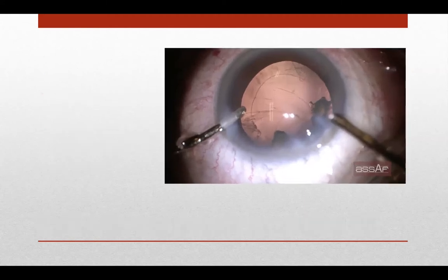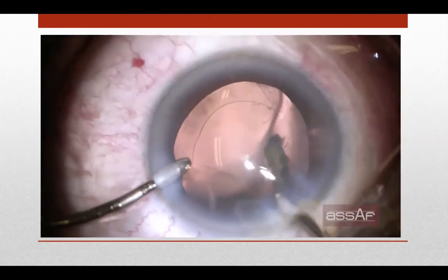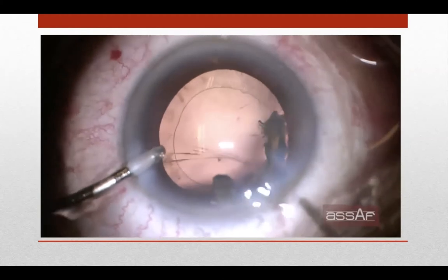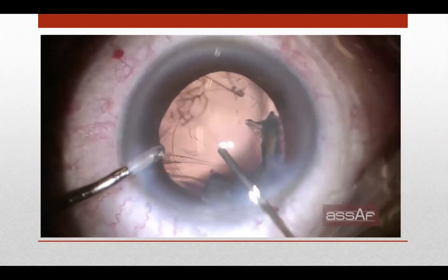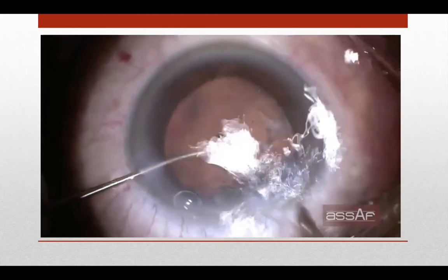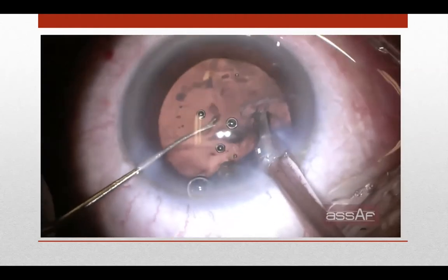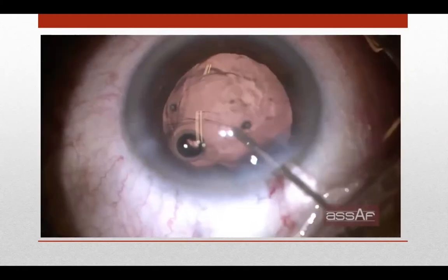So what to do in this case is, of course, we should stop, never allow the anterior chamber to collapse, and inject dispersive OVD inside the capsular bag and inside the anterior chamber to try to minimize the possibility of vitreous prolapse. And now we can continue phacoemulsification. Let's try to clear this epinucleus, and as long as we don't have vitreous, we can continue.